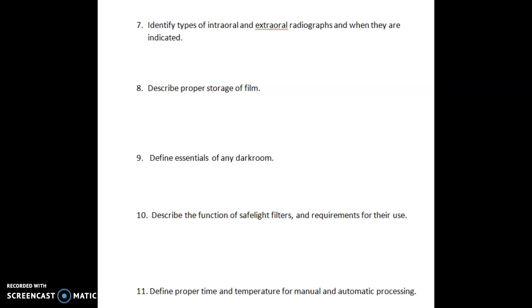So they're great for looking at caries, looking below the contact for any caries or calculus buildup. They're also great because they give you a very natural view that's really representative of the bone height. They give you a good indication of the bone height and the periodontal health along with that.